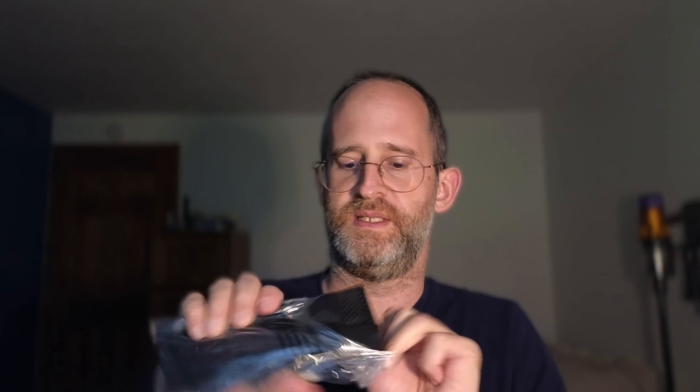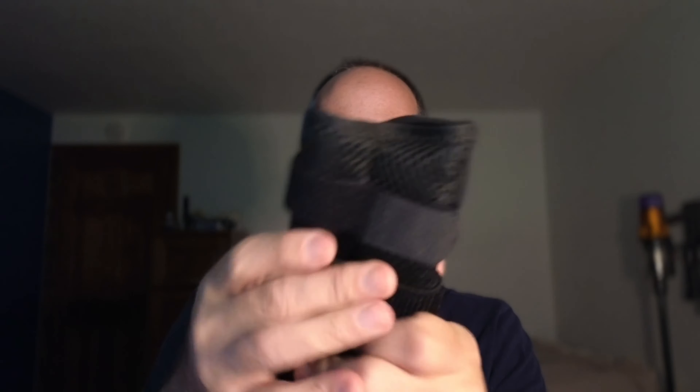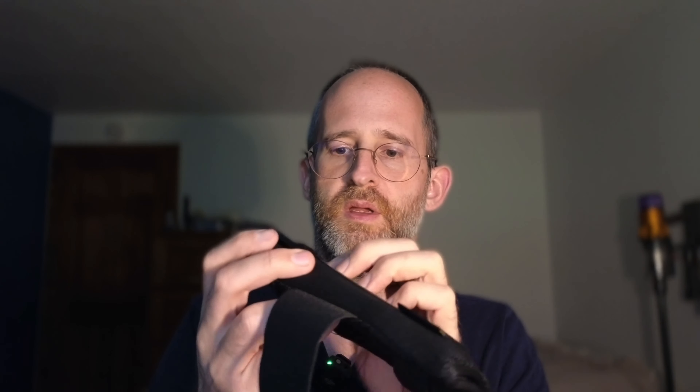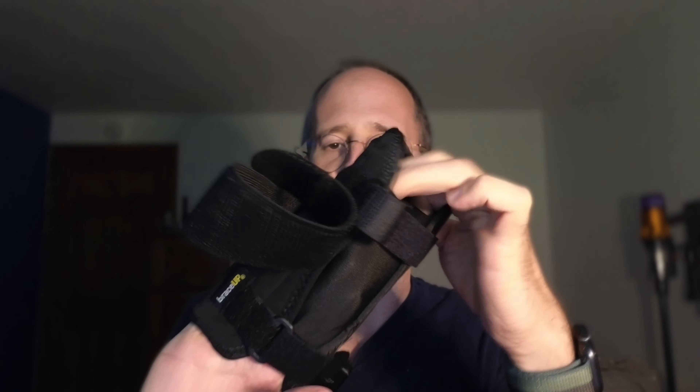So this is what it looks like coming out of the box. You can kinda see it's got these little straps on it. It's got a little material in there as well.